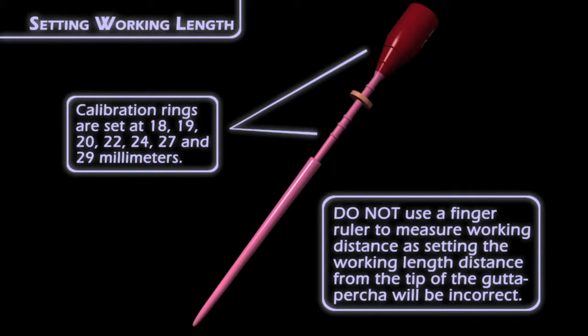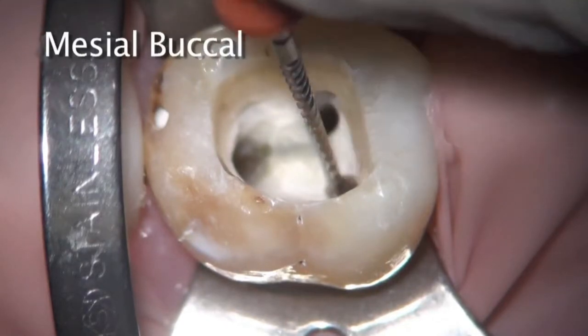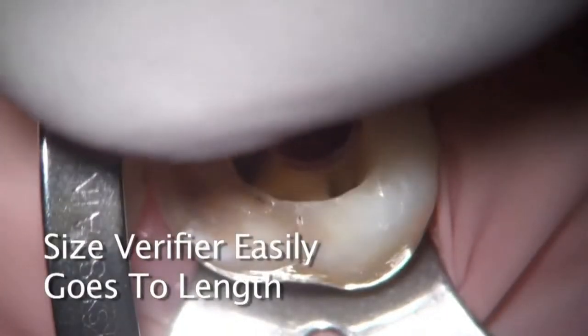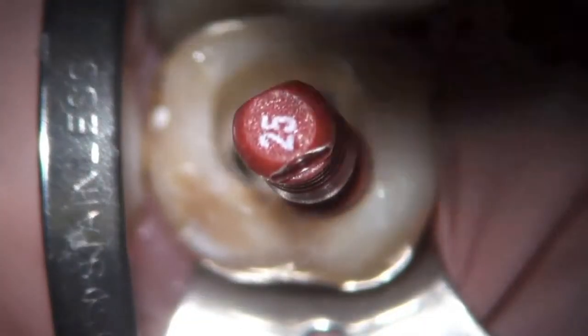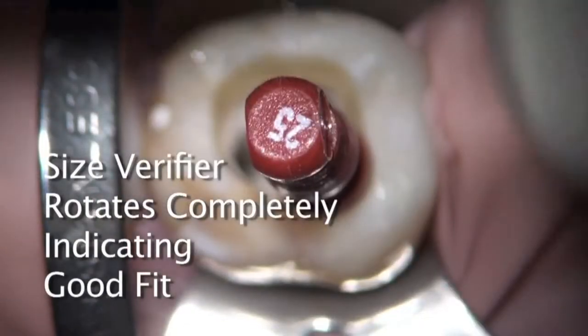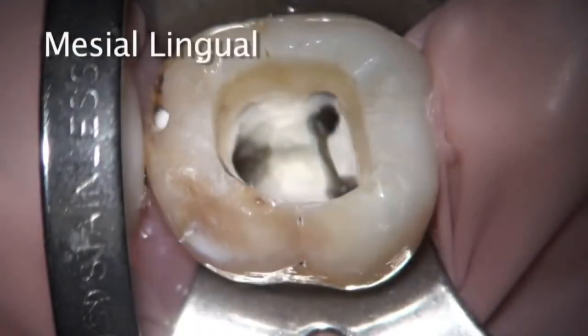Let's take a video and show you size verification. Only after everything is done do we size verify. The canal is completely dry. We're size verifying with a 25 in the mesial buccal — it goes into working length, sitting right on our reference point, and just a little spin around, then back out. Same thing in the mesial lingual.